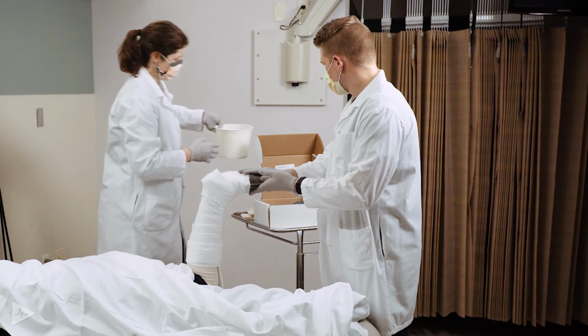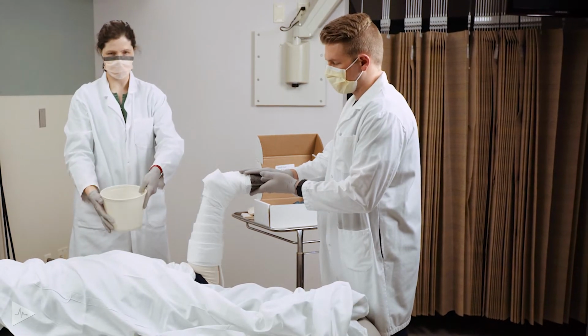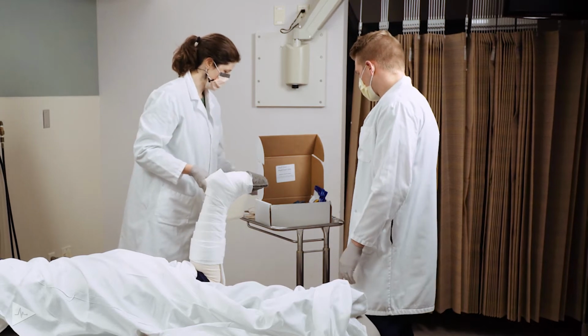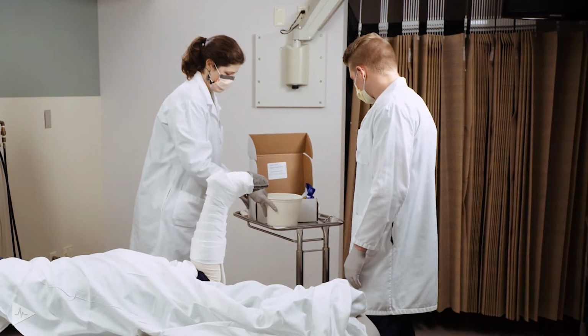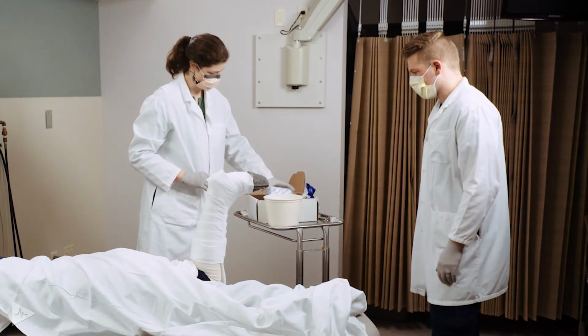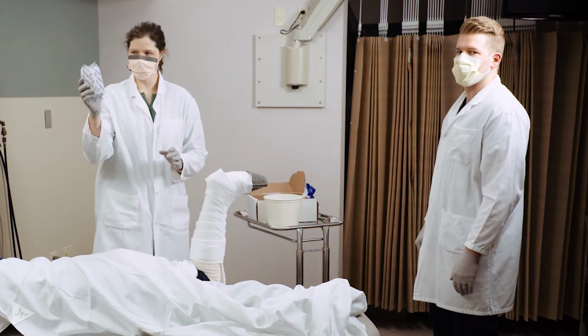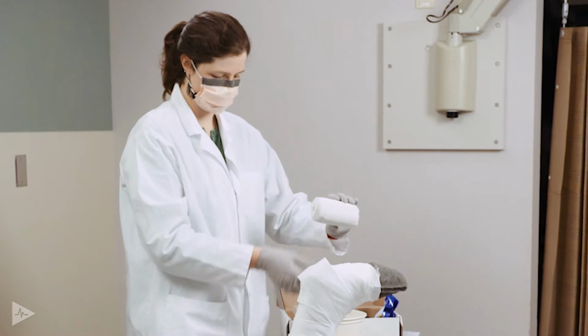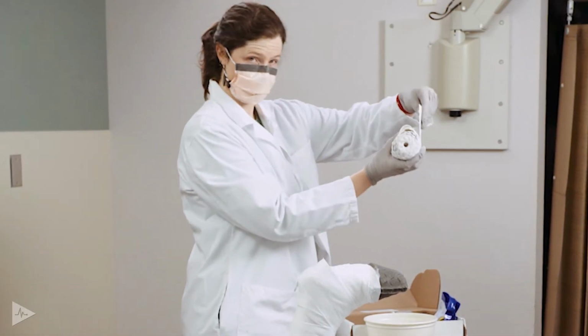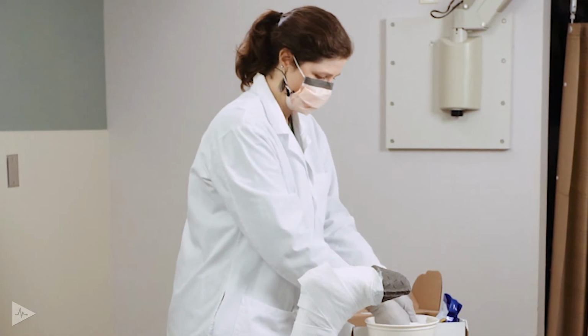You'll want to make sure you have a bucket of warm water. Generally, we will go between 78 and 85 degrees for the water temperature. Then from the cast kit, the first layer to be applied will be the plaster roll. And so this will be dunked directly into your water. So you always want to make sure you hang on to the leading edge of the plaster roll.